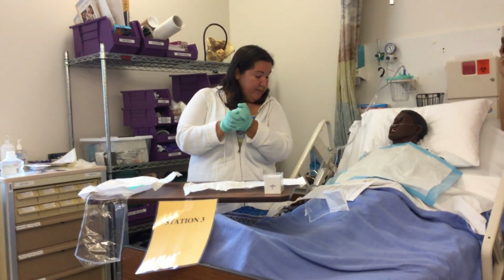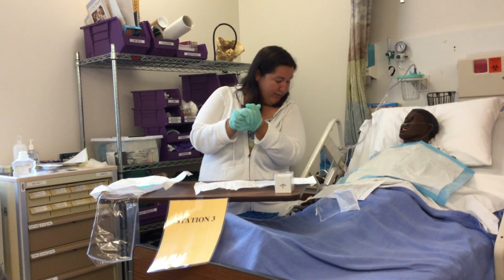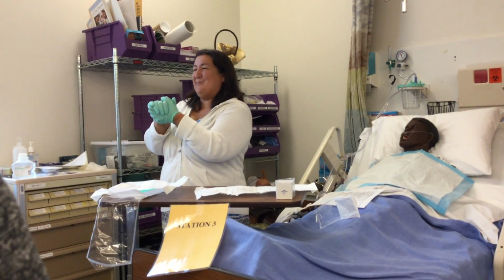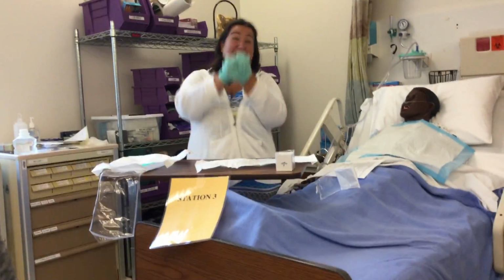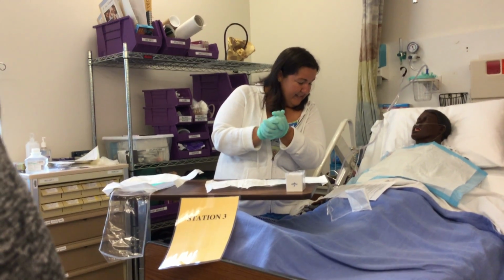So I'm going to tell my patient to take a few deep breaths. I'm sterile now. Sometimes keeping your hands together like this helps, because then it doesn't tempt you to touch your nose or other things while you're doing it. You see that in the OR lots of times when they're not doing anything, they tend to do this, because naturally if our nose gets itchy, we're going to want to reach for it, but when you have your hands closed, it makes it less likely that you're going to reach for stuff. Just keep your hands together, because they're both sterile, they're fine to be together.